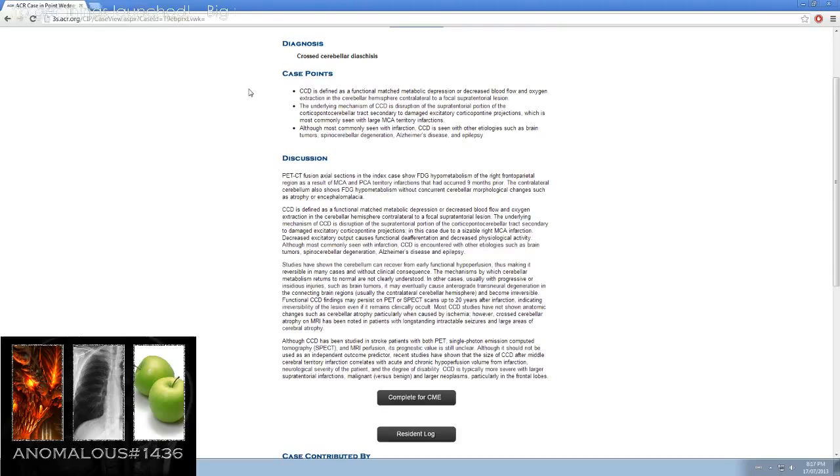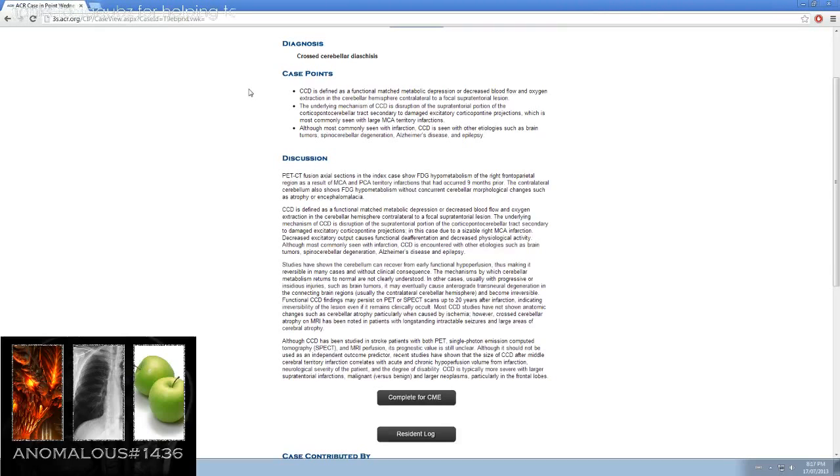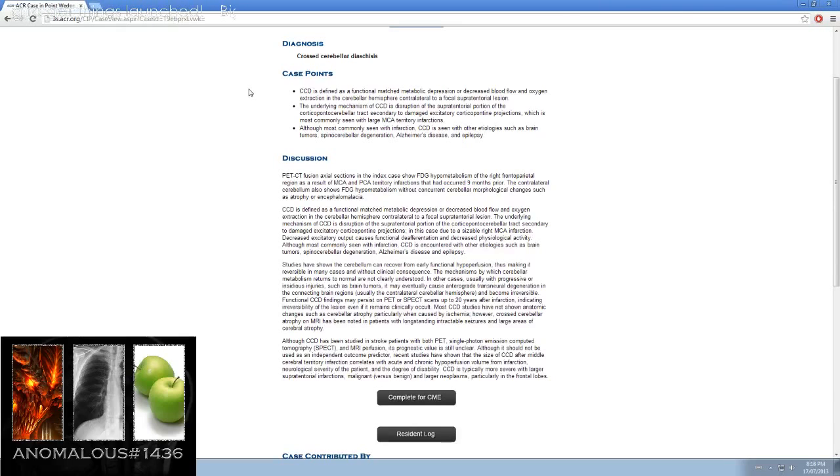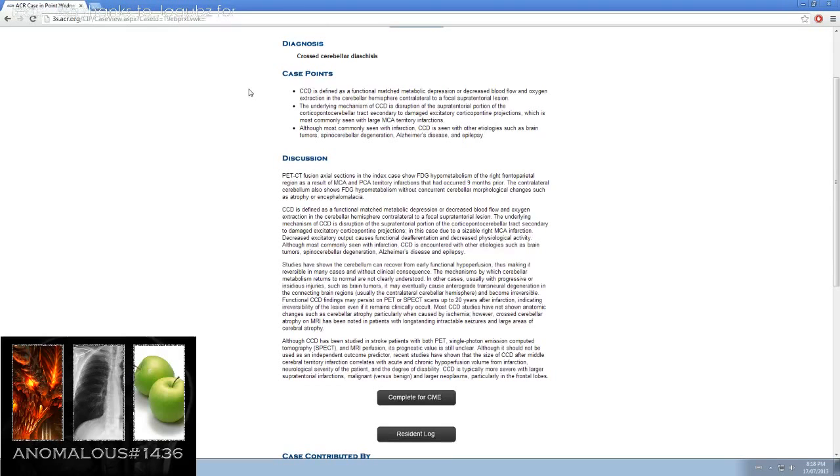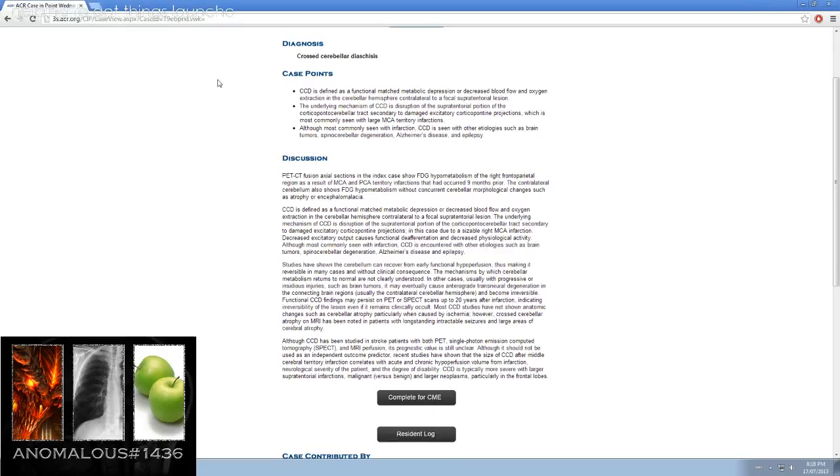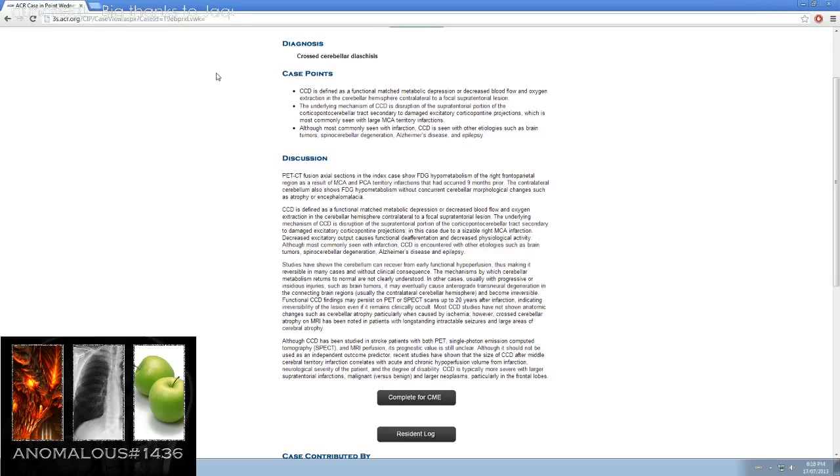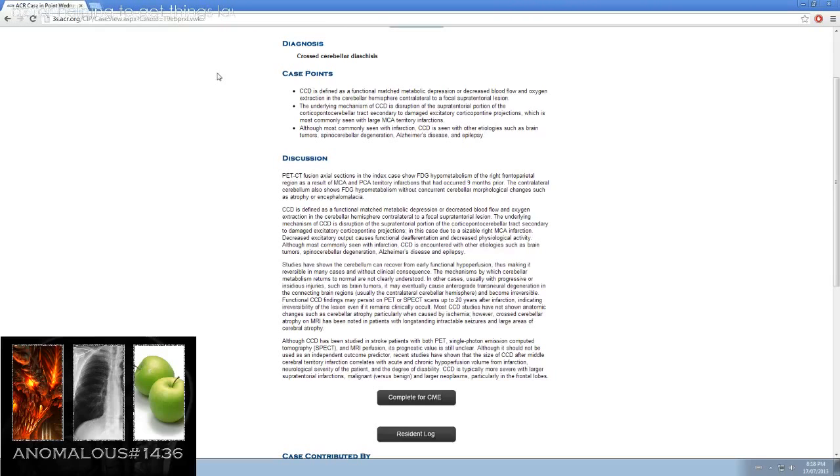Although most commonly seen with infarctions, CCD is seen with other etiologies such as brain tumors, spinal cerebellar degeneration, Alzheimer's disease, and epilepsy. PET-CT fusion axial sections in the index case show FDG hypometabolism in the right frontal parietal region as a result of MCA and PCA territory infarctions that occurred 9 months prior. The contralateral cerebellum also shows FDG hypometabolism without concurrent cerebellar morphological changes such as atrophy or encephalomalacia.